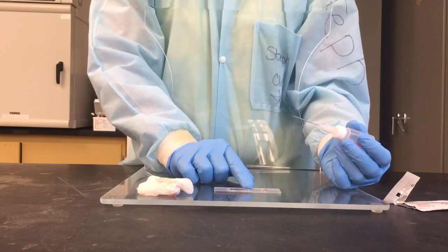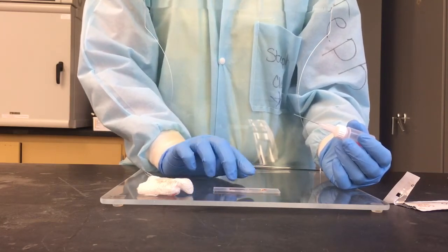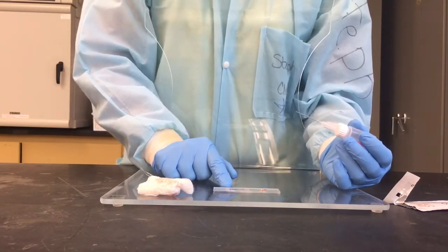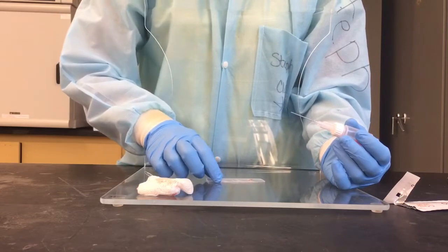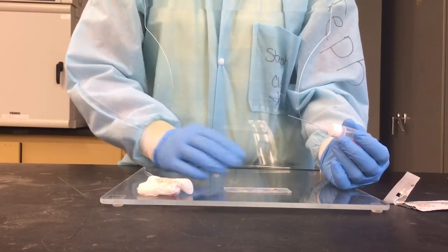If you have a space that is lighter than the rest of that channel, your hemocytometer is underfilled and you need to continue adding drops until you've filled the entire channel. I will show you what it looks like if you've flooded it and if you've overfilled it and flooded the moat. It's much harder to do that on these than it was on the old hemocytometer, so hopefully we won't have that problem.